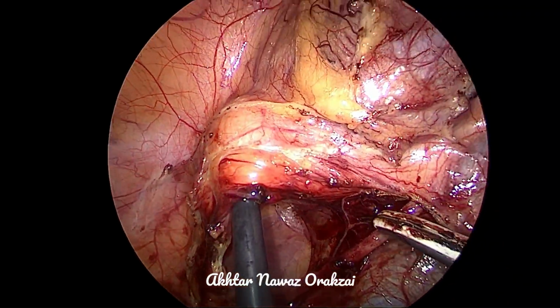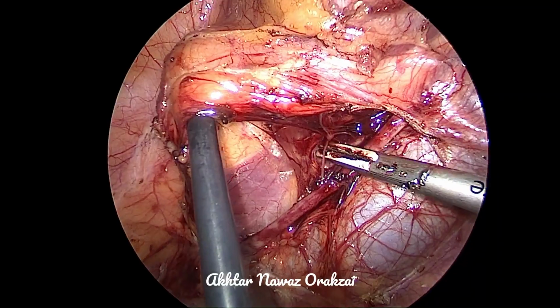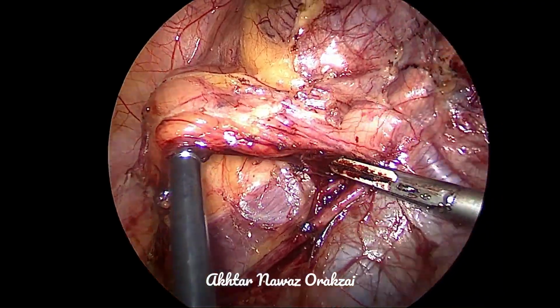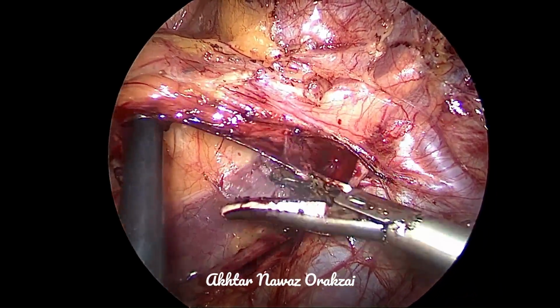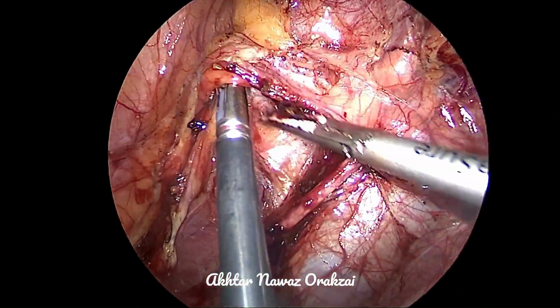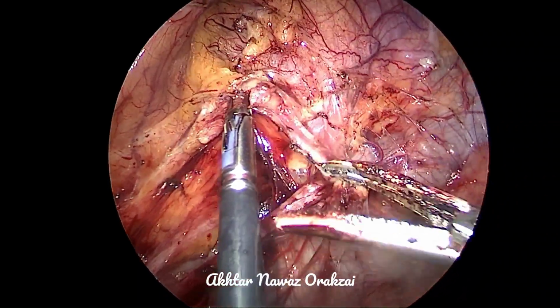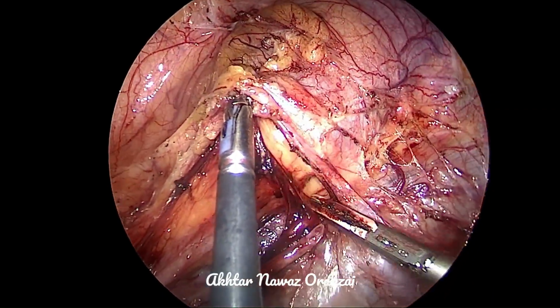It is important to make the window lateral to the gonadal vein here, because as we know, the gonadal vein is directly draining into the IVC, and a little bit of pressure can lead to avulsion of this vein from the IVC. That's why it's important to dissect and make a window lateral to the gonadal vein, so that the lower pole of the kidney can be mobilized.